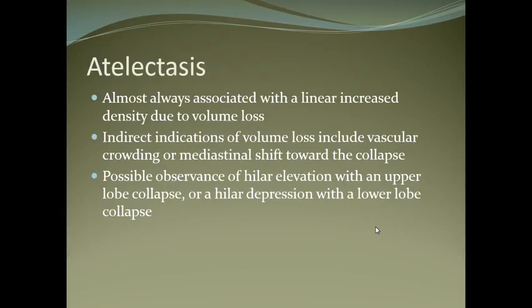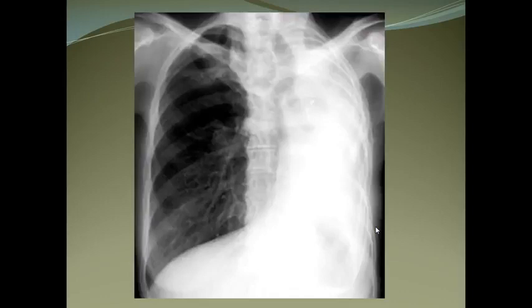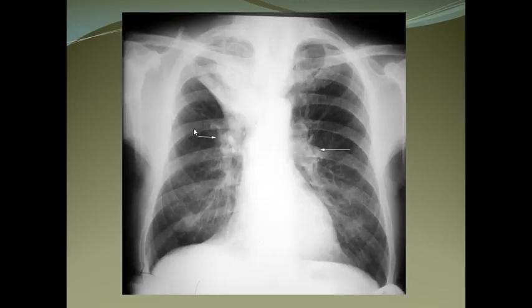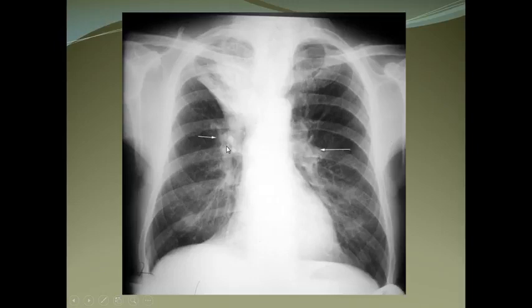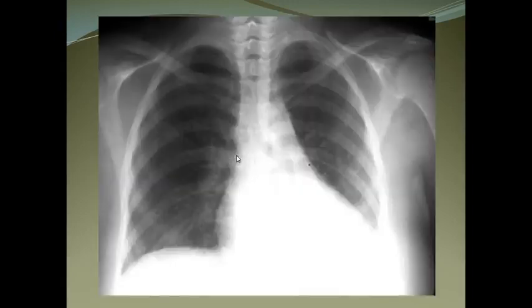You can see complete collapse of the left lung — the left lung is not visualized and the right lung is hyperinflated. Then you can see consolidation and collapse of the right upper lobe with elevation of the right hilum. Both hila are enlarged, due to a neoplastic lesion in the right upper lobe causing secondary atelectasis and elevation of the hila with bilateral enlarged hilar nodes.